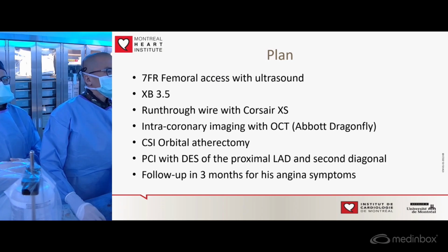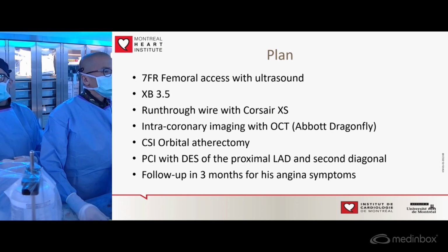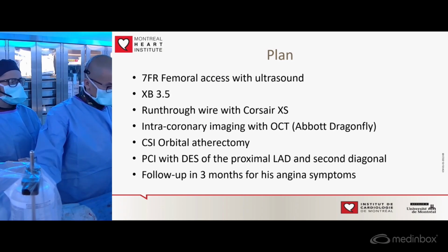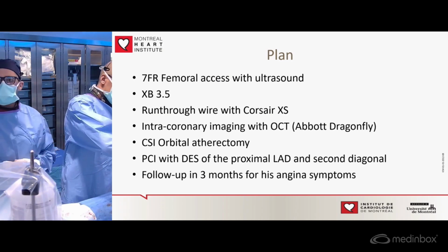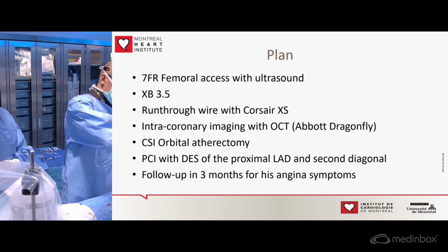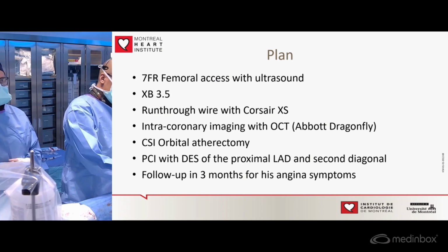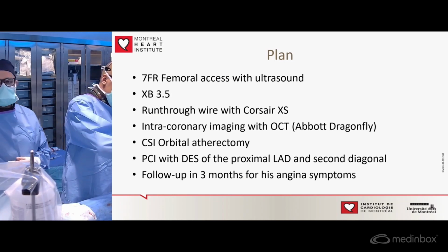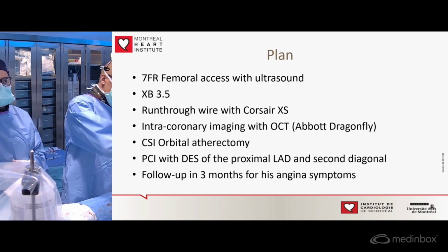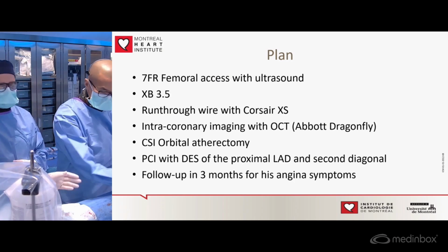The patient had some accelerating angina, but he had a normal ejection fraction and anterior ischemia on the MIBI. He did not want to have coronary artery bypass graft, did not want to have a median sternotomy, and wanted us to do everything we could percutaneously. We divided the problems in two. There is a proximal LAD with a second diagonal lesion. They're heavily calcified, but they're patent. And there's also the CTO of the LAD.